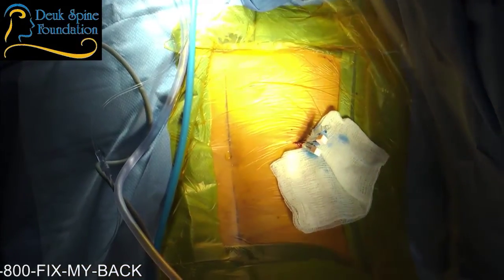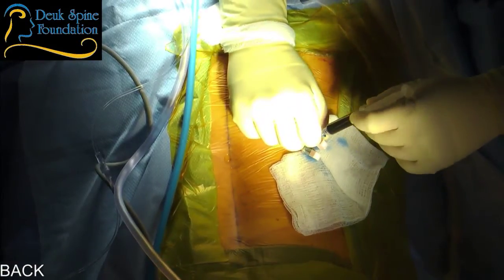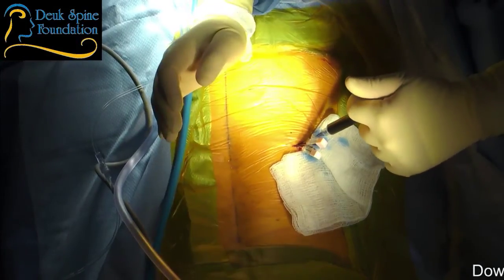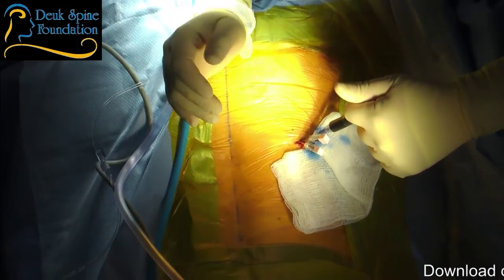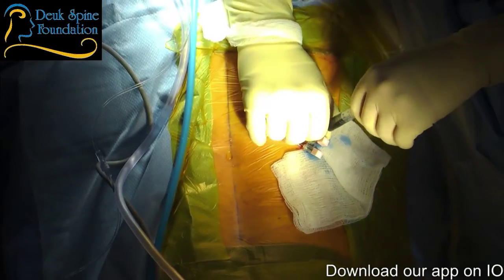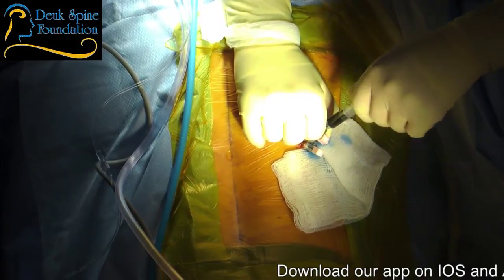All right, so that's 2 discograms, and we need to do the discograms anyway because we're staining the degenerated disc with this blue dye. I can see she's responding. Her back is tensing up. So, and you can see there's tears. Go ahead, at each level.